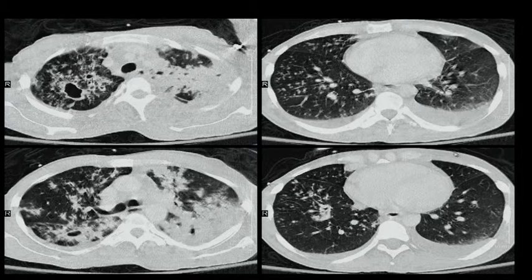So, in the upper lobes, I see these cavitary nodules, predominantly in the upper lobes, multiple ones. There's some mild, maybe pleural effusions bilaterally. Okay, now stop. Now, don't look at the CT. There is a patient who's got a cavitary lesion in the upper lobe with pleural effusion. First diagnosis: TB. This is TB.